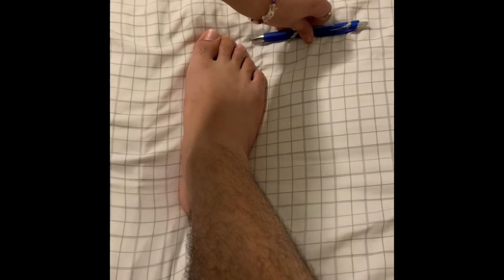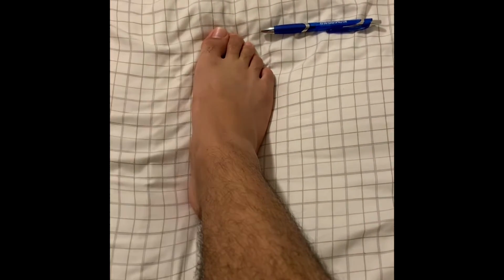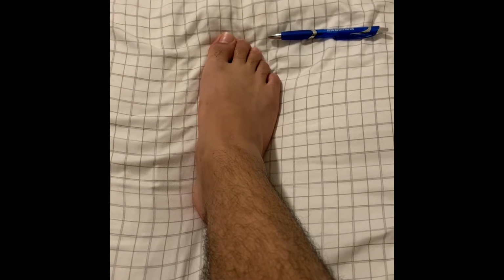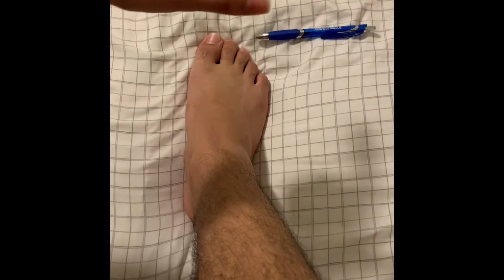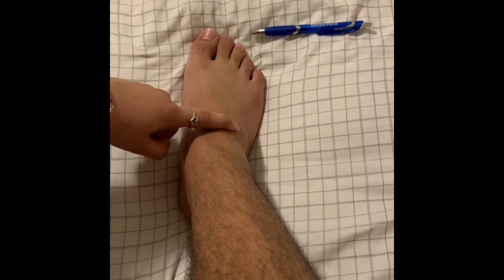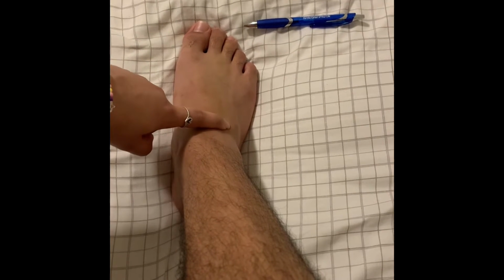So the marker is right here. We have the foot here. Okay, I forgot the name of the light, but we have the light up here, correct? And then it's going to be down the foot, and that is our AP projection of the foot right here.